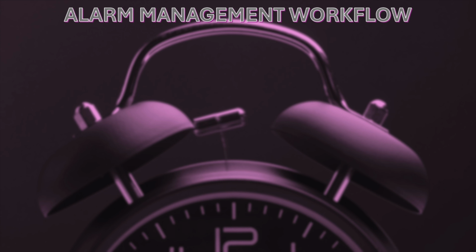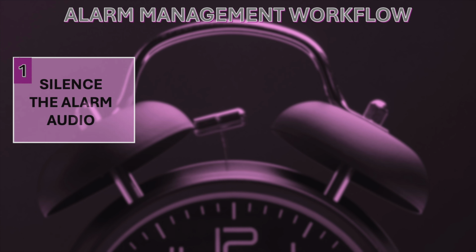Step 1. Silence the audio, or mute. The alarm noise can be overwhelming. Press the mute button on the ventilator to silence the alarms. This action will allow you to investigate the cause without distraction. A solid red light next to the mute key indicates that the alarms are muted.